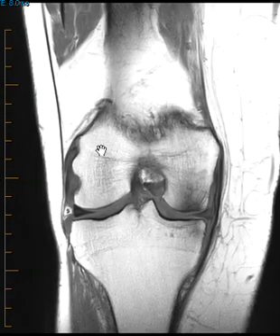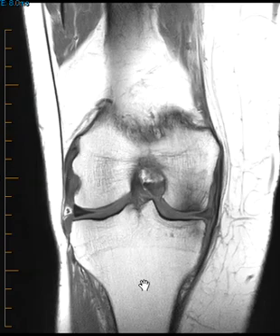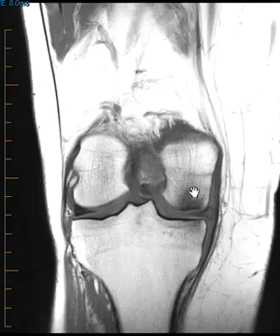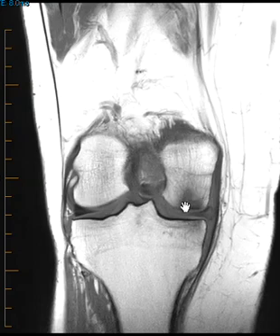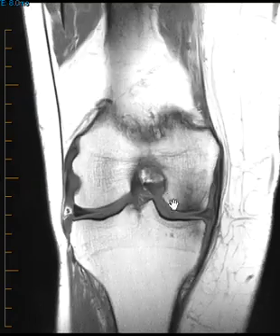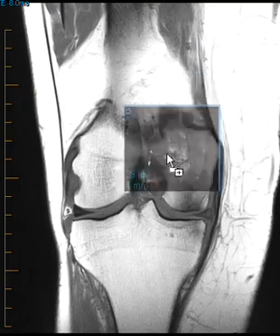Just on this one midline cut, you should be able to say, 'I think I know what this is.' We see marrow edema at the medial femoral condyle, and there's darkness beneath the articular surface — really prominent edema here, maybe some trabecular compaction and marrow edema around it.